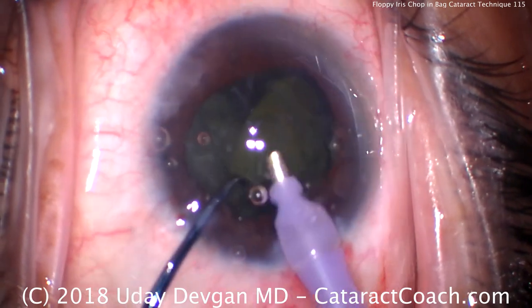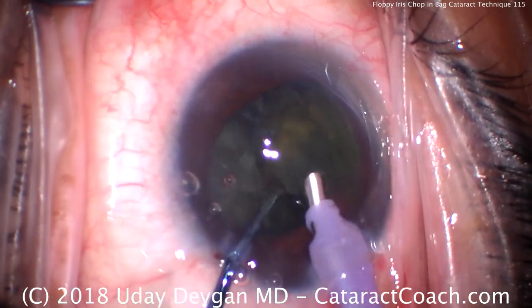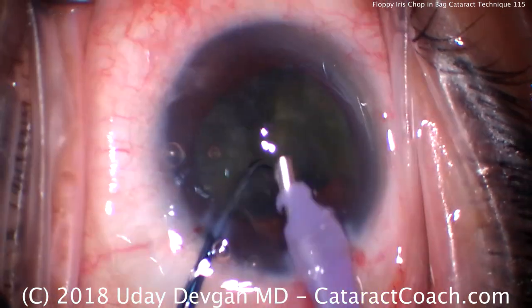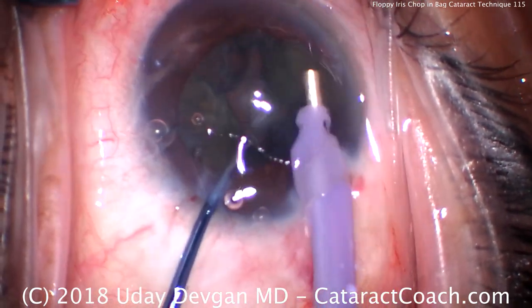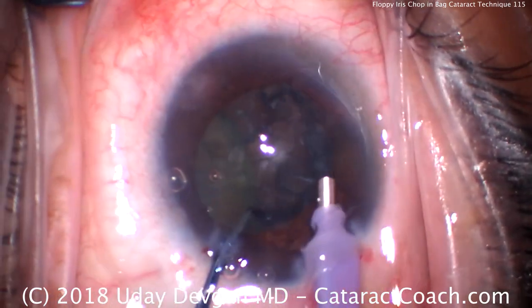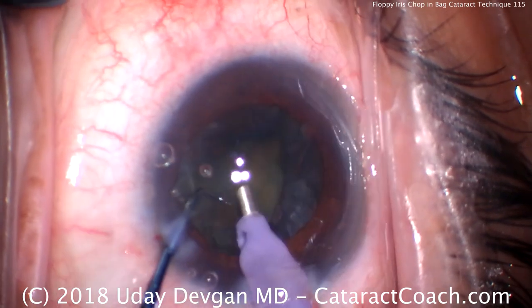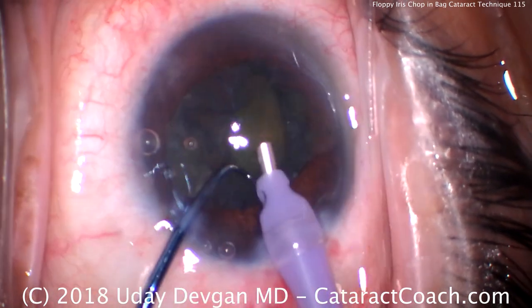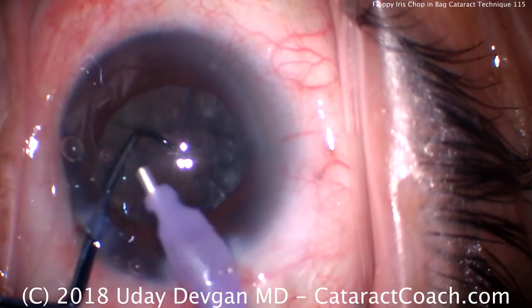Advance the chopper together and apart — and there we go. We split the nucleus into two halves. Bringing up the first half of the nucleus and emulsifying it in pieces at the iris plane, just taking our time. We keep the other half of the nucleus in the capsular bag, so we've removed just about half the nucleus so far. Here comes the second half — bring it up. We feed it into the phaco probe with a little bit of phaco power, and that looks pretty good.